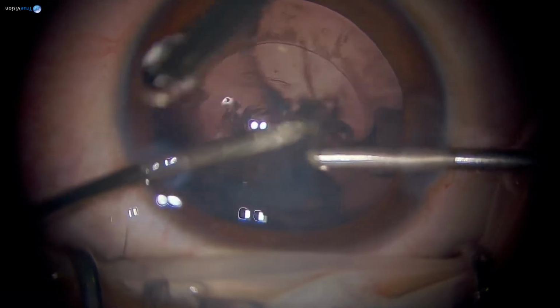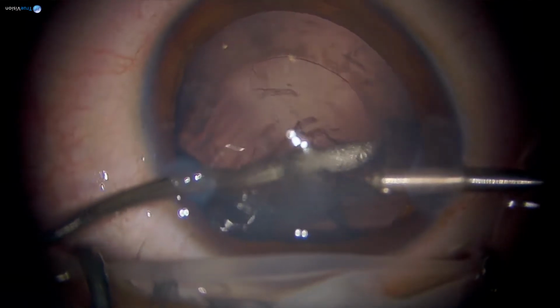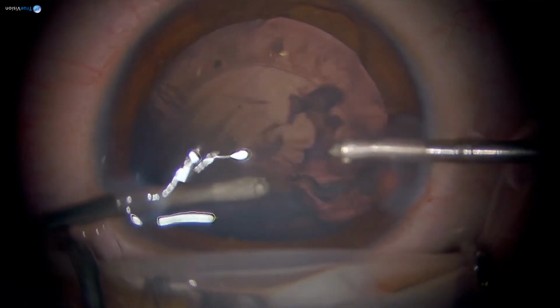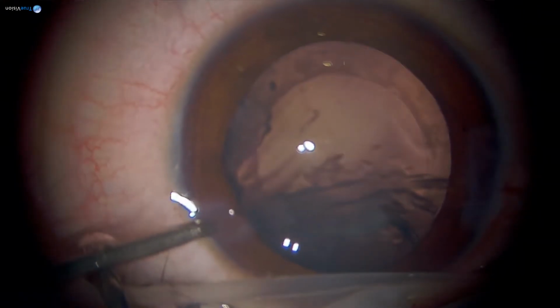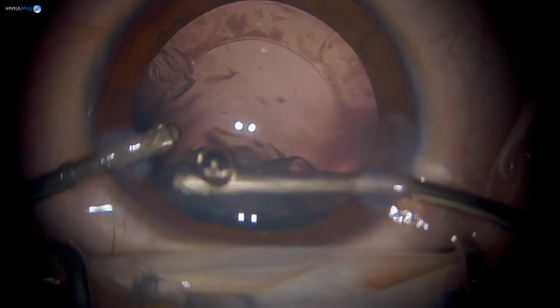So this is taking a little bit long because we have increased the size due to the difficulties we had in the anterior capsulorhexis. So whatever depth you have, you can't have the complete depth with this larger incision. So it will take some time. So you have to be patient. Then you can give a better outcome for these patients.